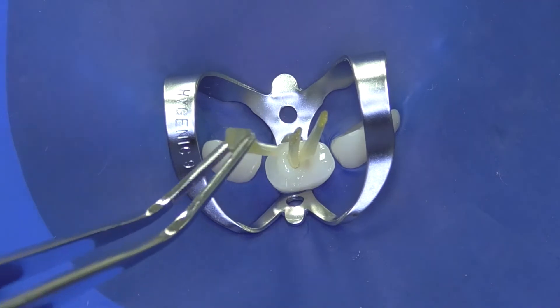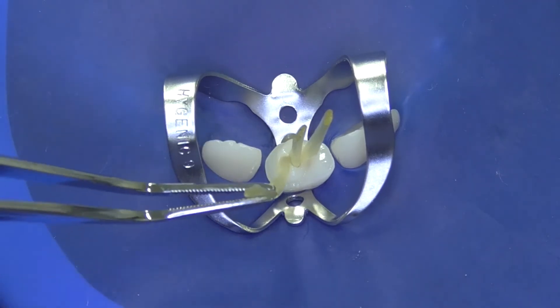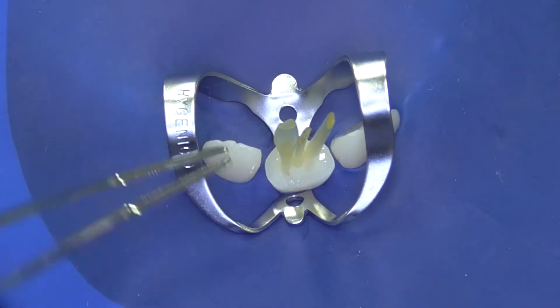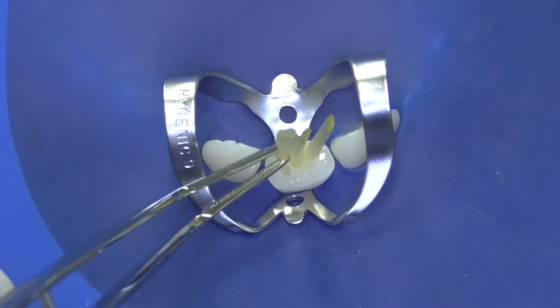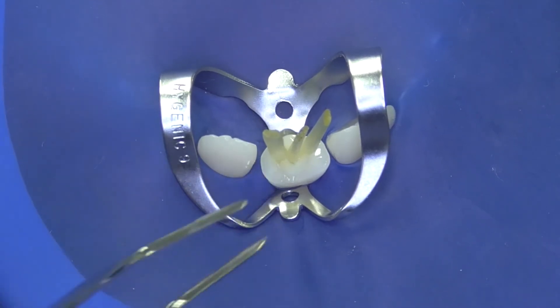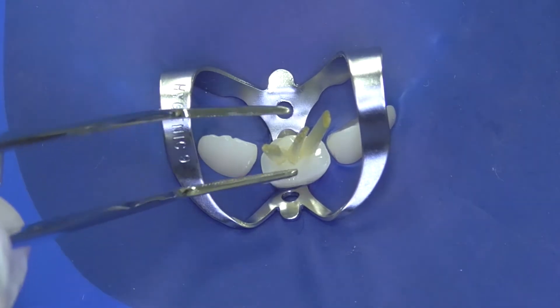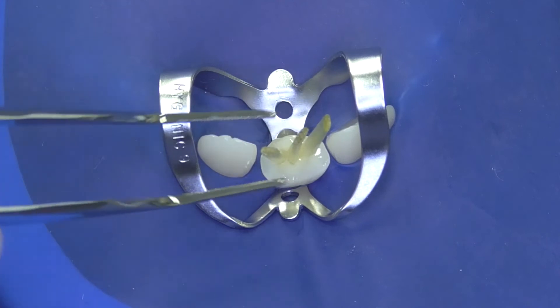Before we are starting light curing the cement and the post simultaneously, it is possible to bend the fibers to have better angulation to the direction of the coming core and the coming crown.